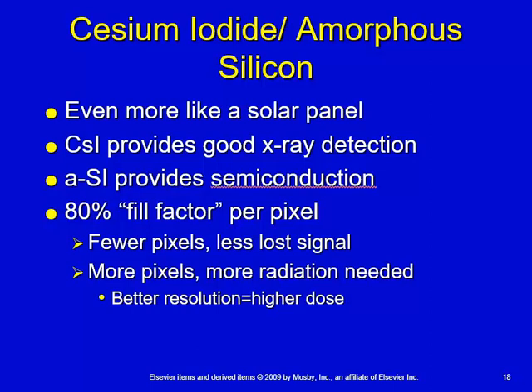If you're looking at page 301, that would be your pixel detector. But you've got the thin film transistor and storage capacitor, and those two are not sensitive to radiation. So the example that they're using here is that for each one of these pixels, only 80% is sensitive to the signal, to pick up the signal for manipulation, processing, and eventually signal display.